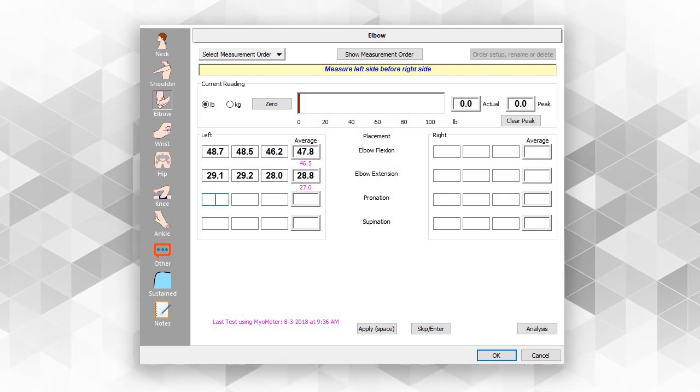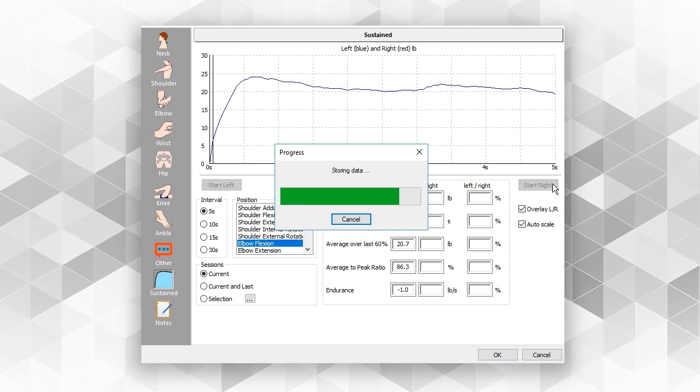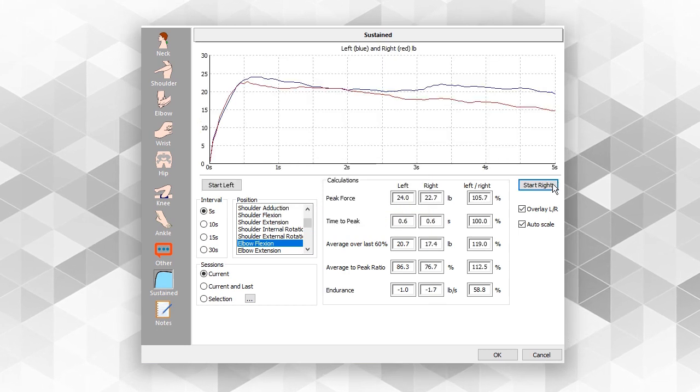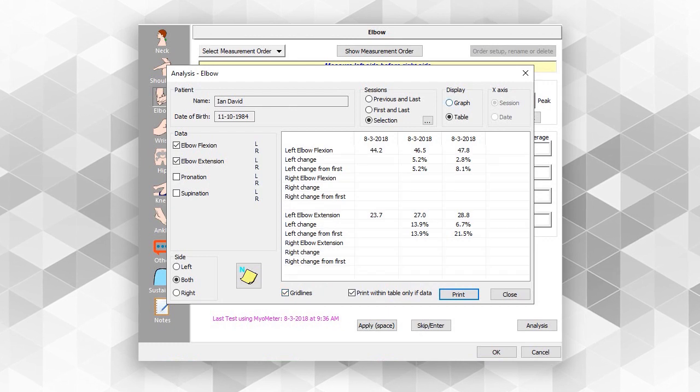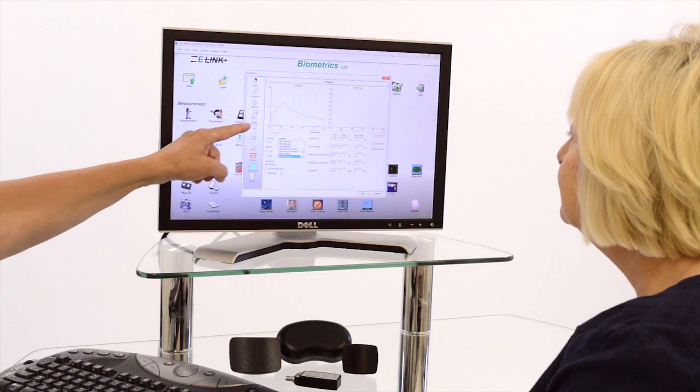The e-link software also includes a sustained force test that can be undertaken for 5, 10, 15, or 30 seconds, and comparison to an earlier test can be recorded, thus monitoring progress.